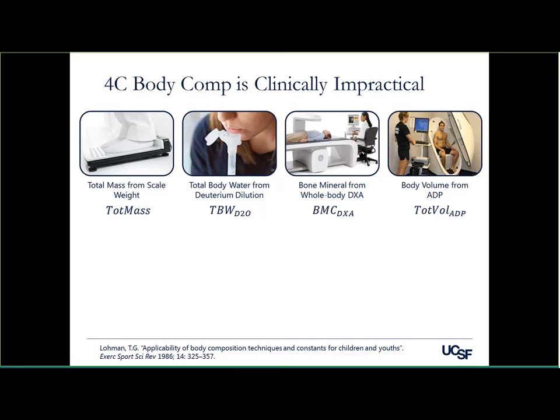So my question to Steve was, DXA's in the four-compartment model. Why doesn't one use the soft tissue information that's in the DXA in the model and make it simpler? And his answer was, I'm not really sure. But I looked at this for about a year, and I found out it's because you can't do it. You can't pull water and protein out from each other, so it can't simplify it. You've got to do something more.